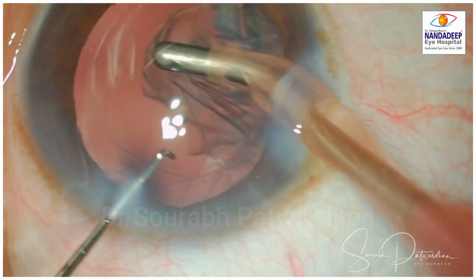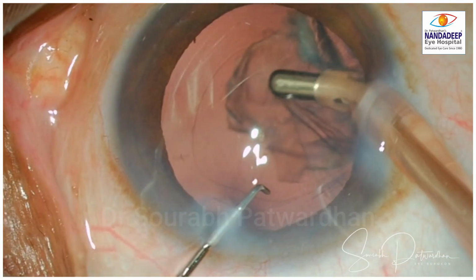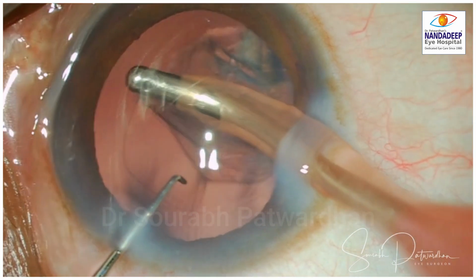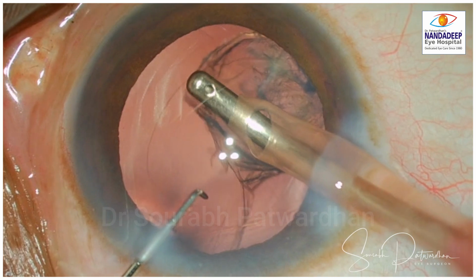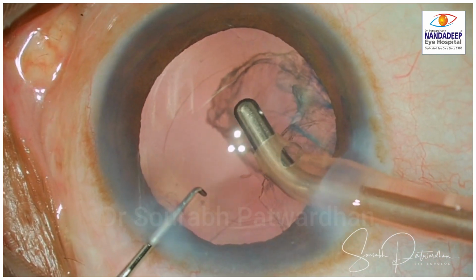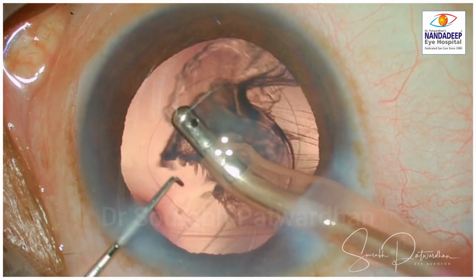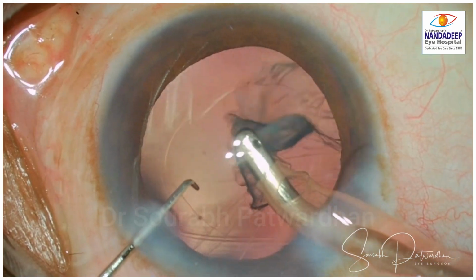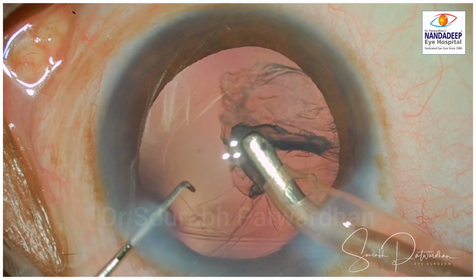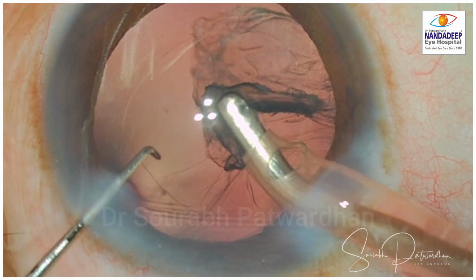You can see that the posterior capsule comes up and gets dragged, indicating that there is a weakness of zonules, and it's restricted to posterior zonules because you can see the anterior capsular rim is quite intact. Despite that, you can see the zonular weakness in almost 4 to 5 clock hours. You can see here almost 4 clock hours of posterior capsule which is coming up, and I have to release the cortex very carefully here, not to catch hold of the posterior capsule in this process.